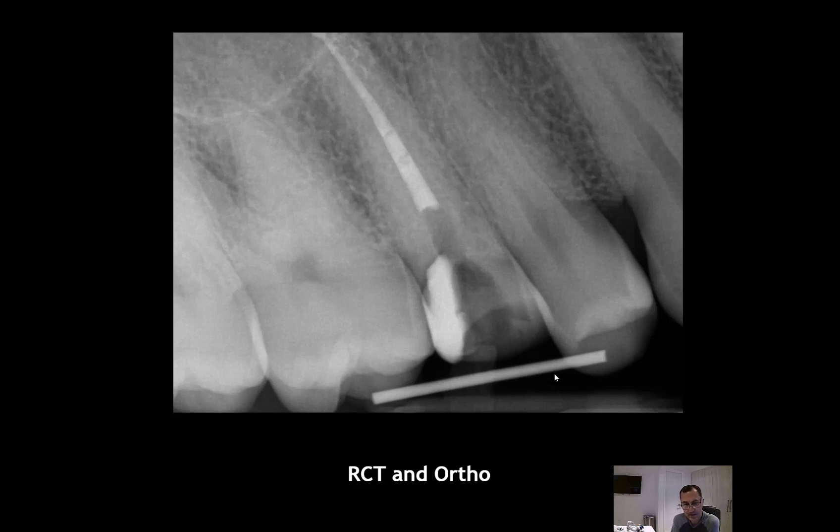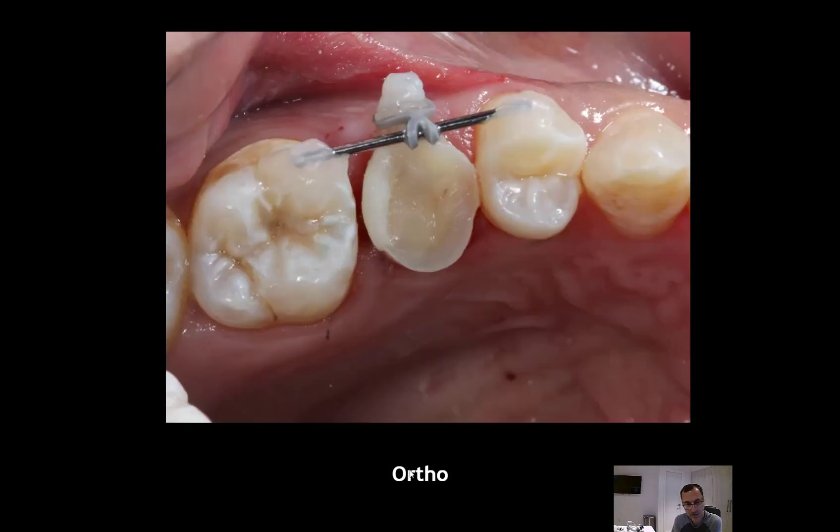People ask when I placed the post — I placed the post the next visit, making sure there was no pain or discomfort first, and then the post and buildup were done. As you can see here, the metal wire is placed on the buccal side. You can place any rigid metal wire; some people suggest placing post material on the buccal — you can do that, but keep in mind it depends on the location of your tooth and what you want to accomplish.